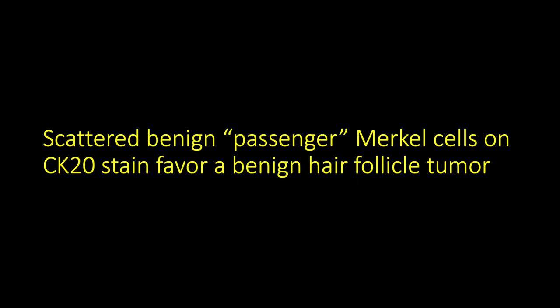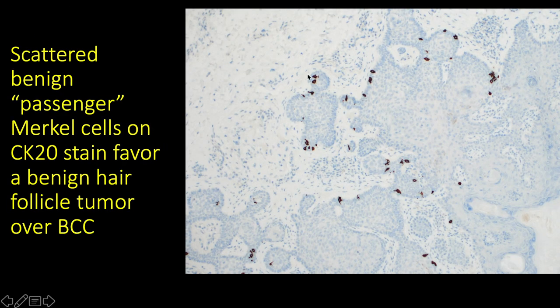One helpful clue is passenger Merkel cells — you can use a CK20 stain, which will show scattered individual cells with the whole cytoplasm staining, scattered throughout the benign hair follicle tumor. I think this was actually a trichofolliculoma, but you can see this in a variety of benign hair follicle tumors. I find scattered CK20-positive passenger Merkel cells within a basaloid tumor to be a helpful finding supporting a benign diagnosis over basal cell carcinoma.